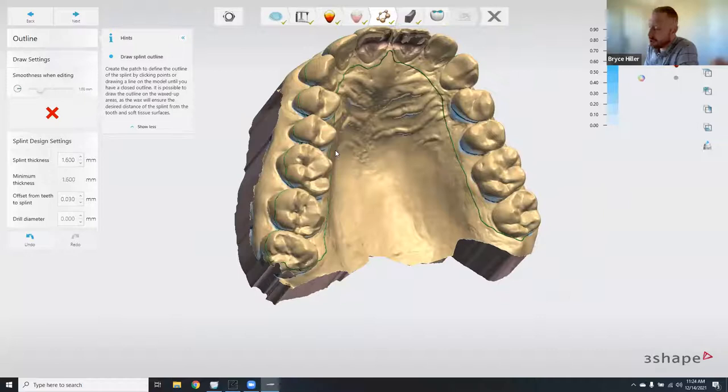Once the line is drawn, there are a few splint design settings on the side — these are locked by the manufacturer. 'Splint thickness' is the minimum thickness. 'Offset from teeth to splint' is essentially your cement gap, a buffer so you can actually seat the appliance. 'Drill diameter' is set to zero for 3D printing — this value accommodates the physical milling tool if the appliance were to be milled instead. Since we're printing with Keystone's design parameters, all of these are locked anyway.